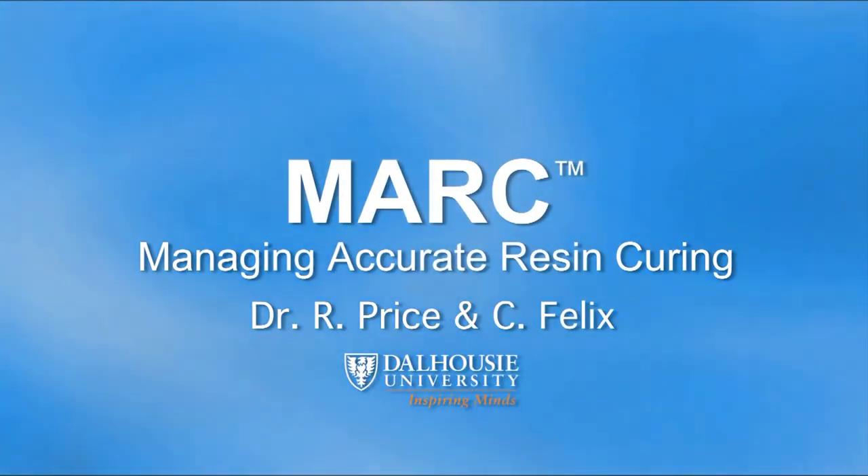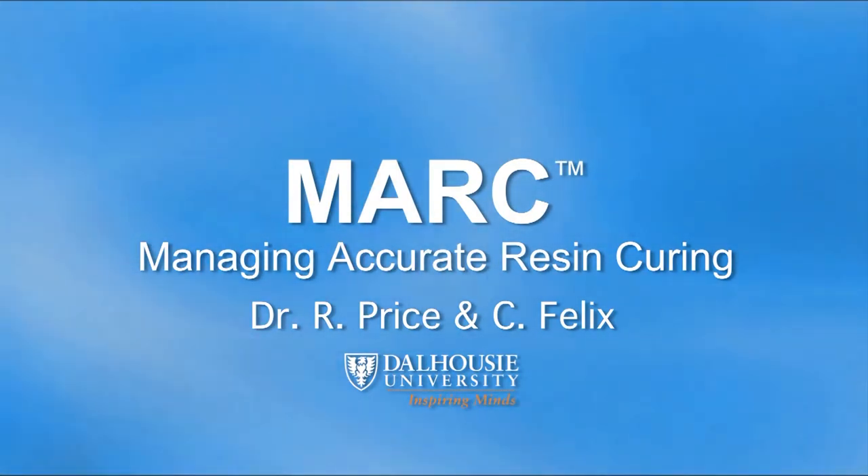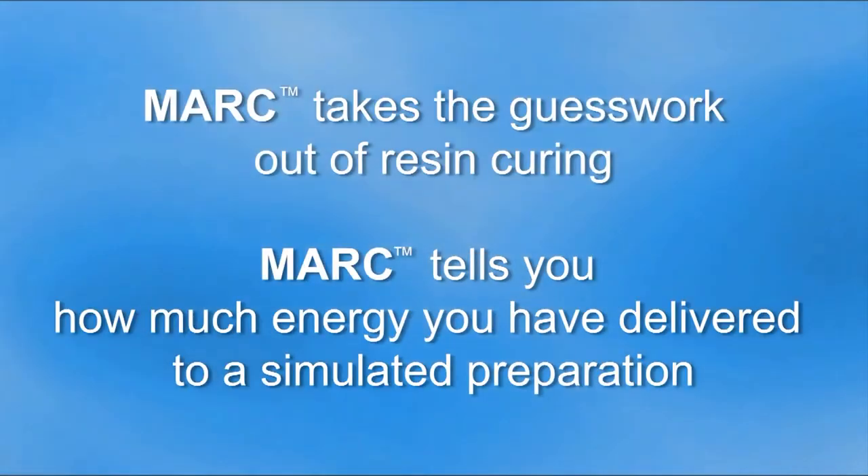This video will use Mark to demonstrate the effect of operative technique on the amount of light energy delivered to a restoration using the same curing light. Mark takes the guesswork out of resin curing and tells you how much energy you have delivered to a simulated preparation in a mannequin head.